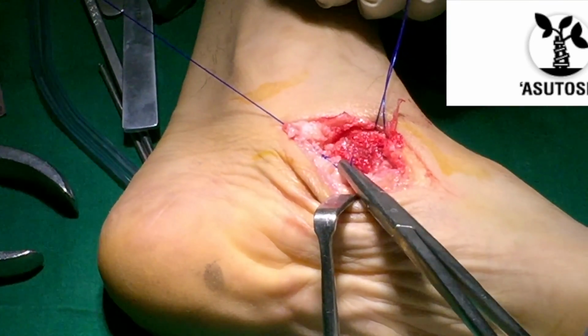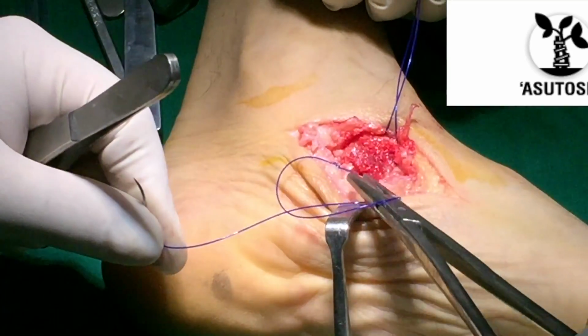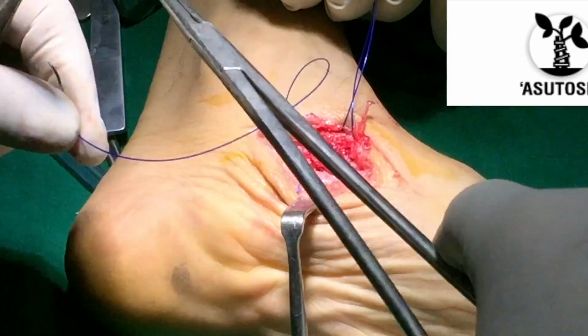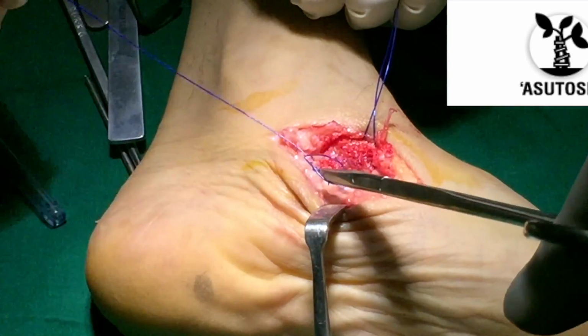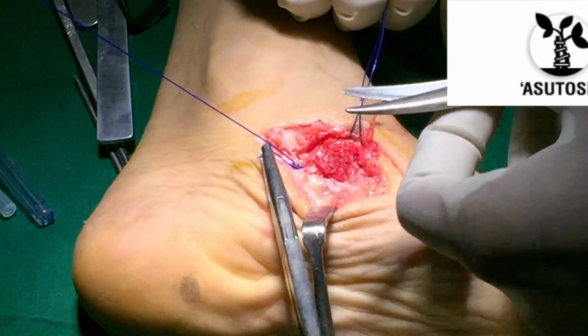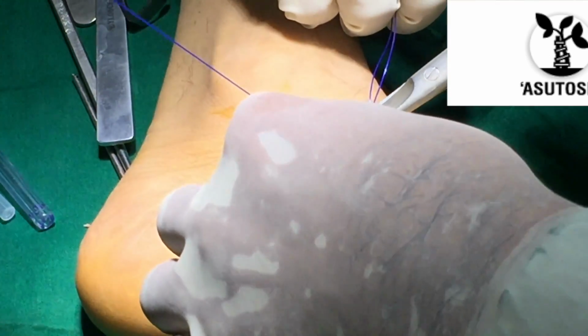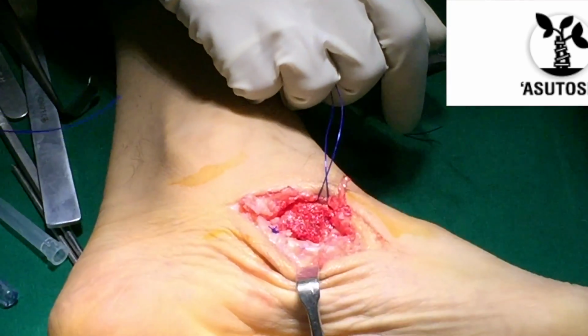So basically we are tensioning the posterior tibial tendon by taking a single knot right now. We need to use Proline suture material with caution because it has a tendency to cause a lot of irritation below the skin of the patient.